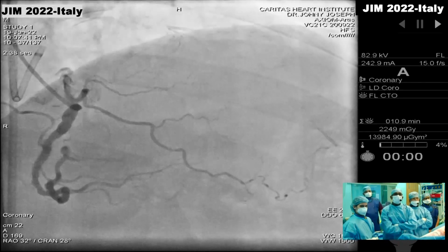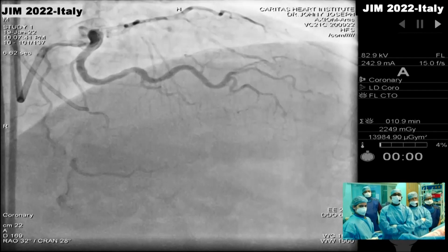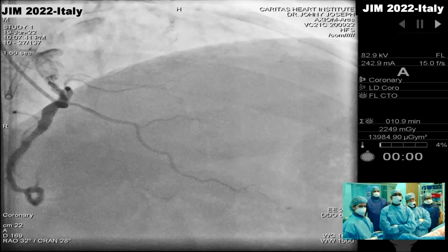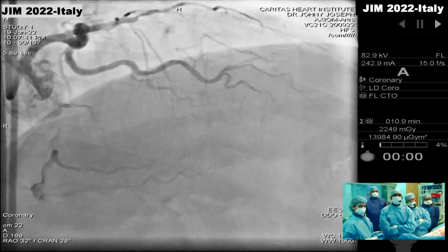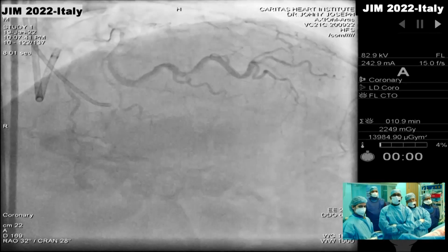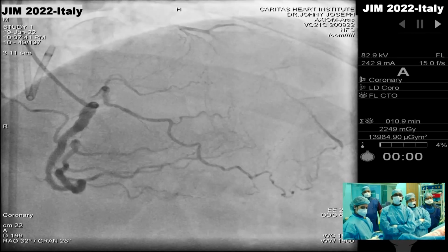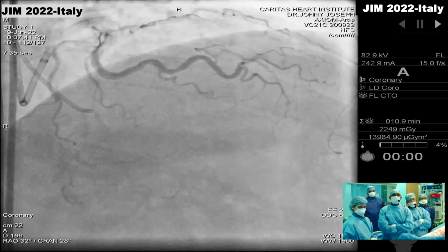Well, I think this is a great result, first of all, in the RCA, so that's definitely very encouraging for this patient. This means he has a favorable vascular response to angioplasty and stent. There are actually tremendous collaterals that allow you visualization of your distal target vessel. I do agree there's a little bit of a stump there, right after the first diagonal.